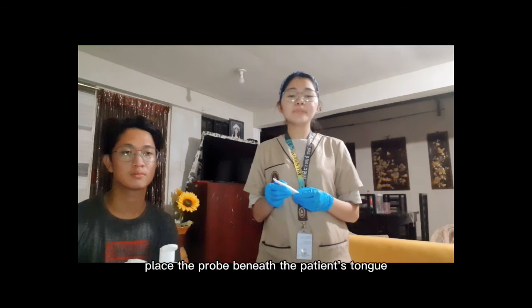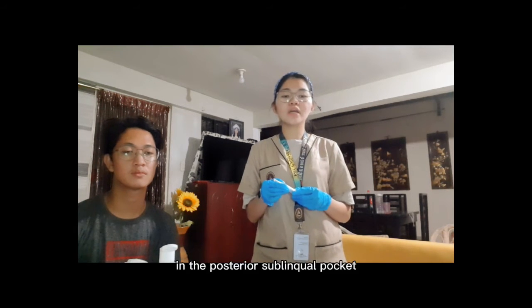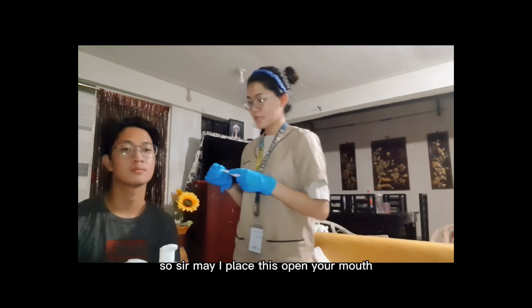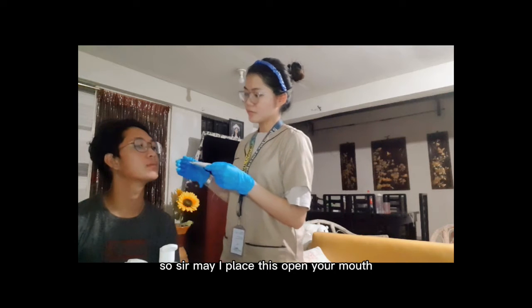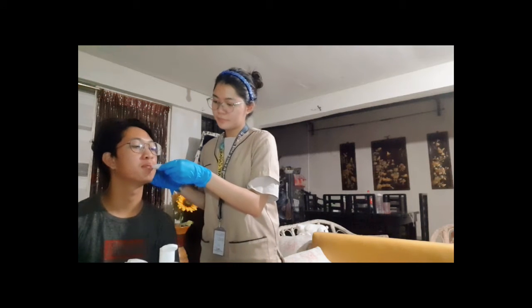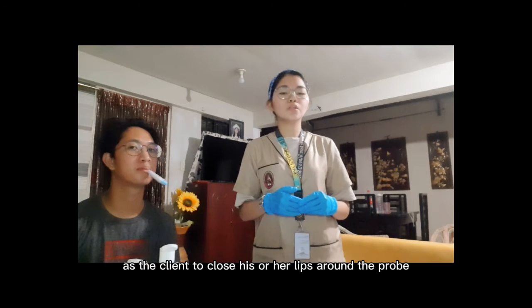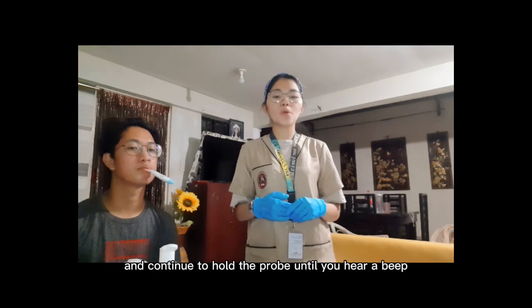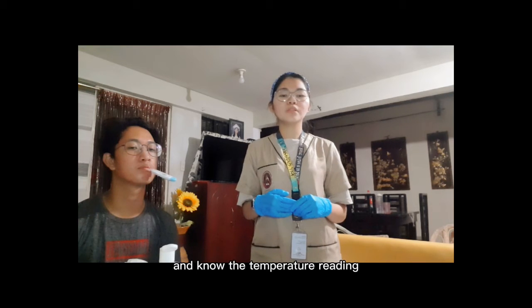Then after that, place the probe beneath the patient's tongue in the posterior sublingual pocket. So, sir, may I place this, open your mouth. Alright. Then, ask the client to close his or her lips around the probe and continue to hold the probe until you hear a beep and note the temperature reading.